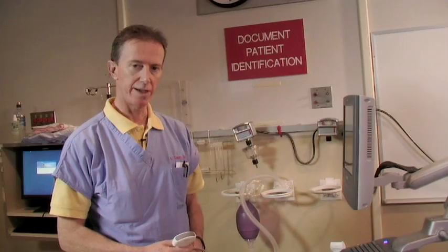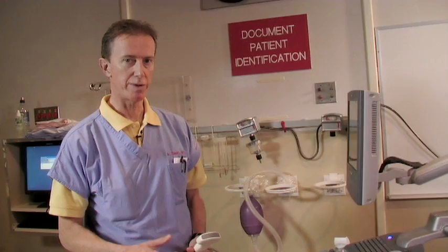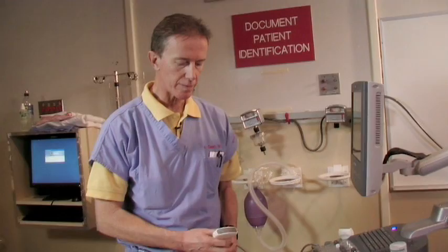We're looking at potential spaces in the body where free fluid tends to accumulate. Once that concept is clearly understood, it's apparent that since it's a potential space, the entire extent of that potential space should be checked for a full and complete evaluation.